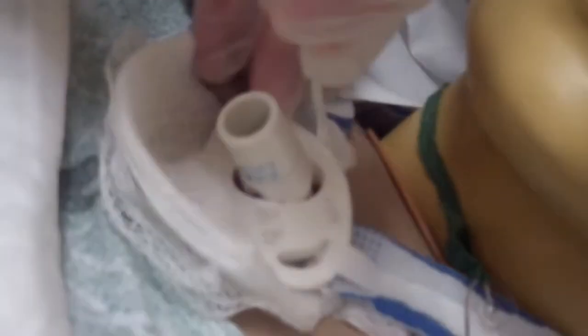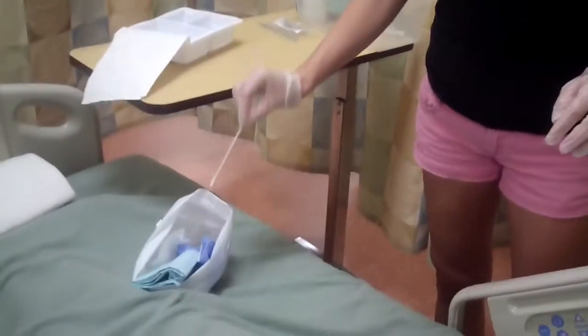and slide this under Miss Jones' faceplate using the non-pokey side to help me push it up so we don't irritate her. Trying to be very gentle and also hold the plate in place without moving it. You can pull that up. We want to make sure it is not too tight, but that it covers all the skin where the faceplate is so no irritation occurs. I'm going to throw this away.